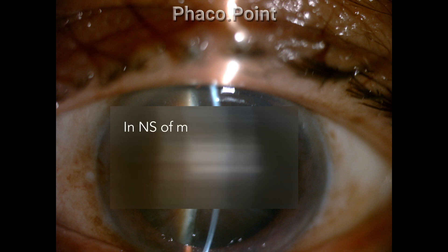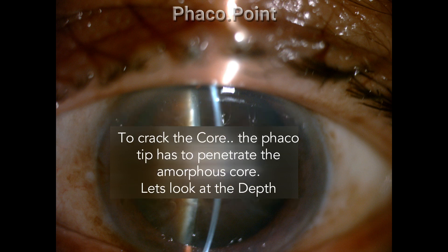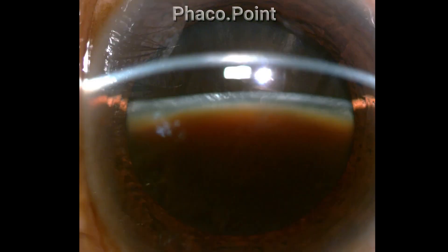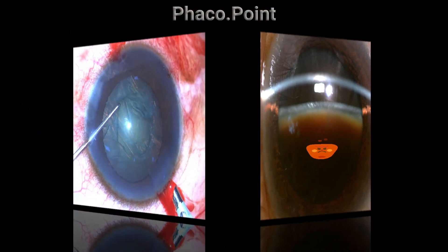In order to crack and split the nucleus, the tip should be buried to just beyond its horizontal midpoint. In a grade 4 cataract, a dense central amorphous core develops due to compaction of lens fibers, typically no more than two millimeters. To crack the core, the tip has to penetrate it. In grade 1 or 2, the tip needs to be buried about one millimeter with a steep or shallow angle. However, in grade 4, a shallow angle will miss the amorphous core — a more vertical angle of attack is essential.